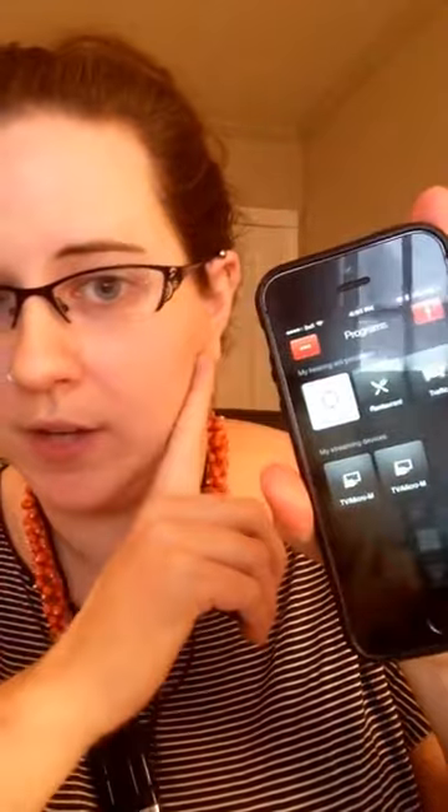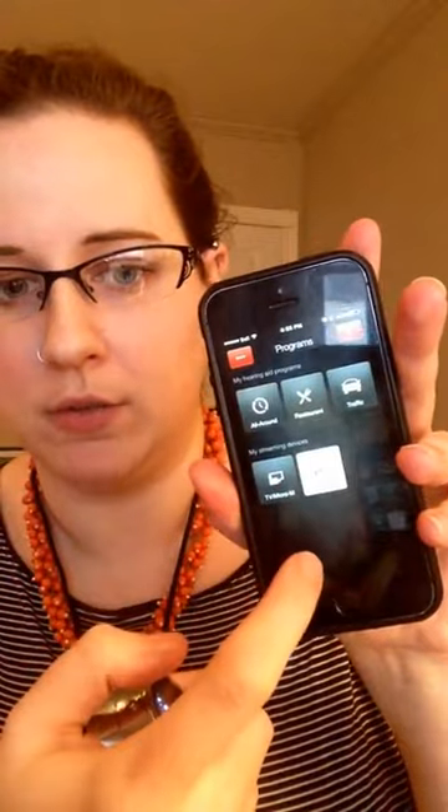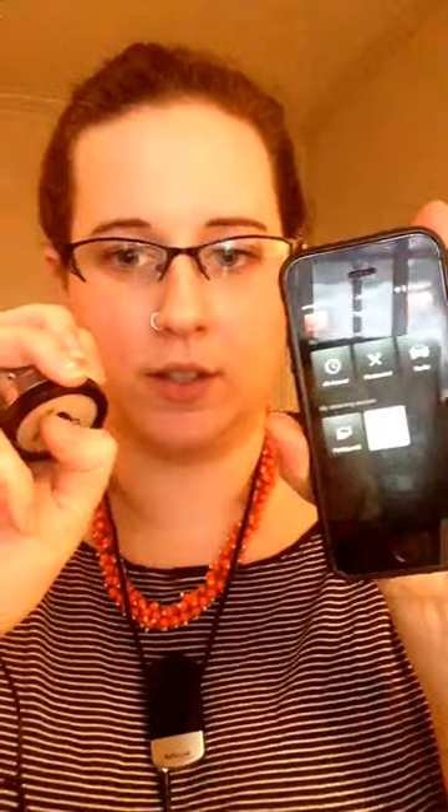Right now my hearing aids are set just to hear whatever's happening in the room. When I set it over to the streamer, because they're connected, it's actually streaming straight from the stethoscope. What I'm hearing right now is the tapping sound on the stethoscope coming straight through to my hearing aids. Generally I just turn this off and on throughout my clinical day and that works really well for me. I hope that is helpful to some of you and hopefully you guys can get connected.